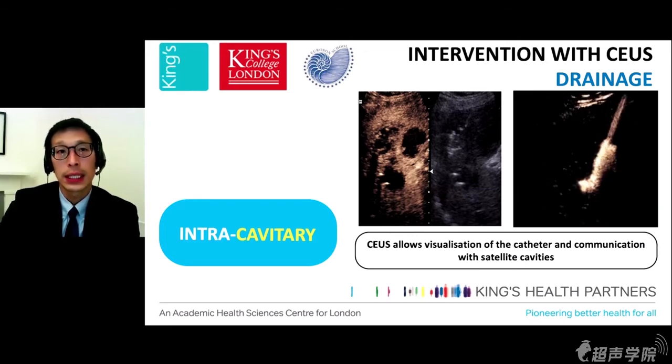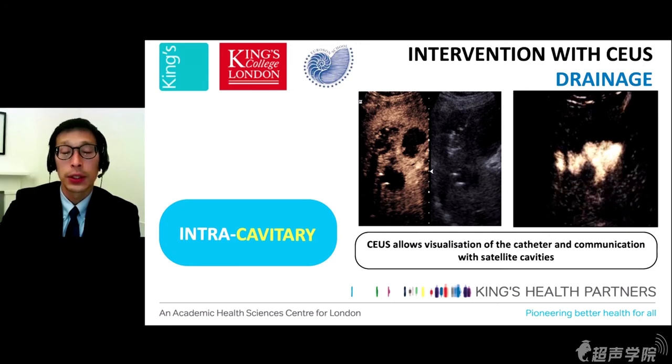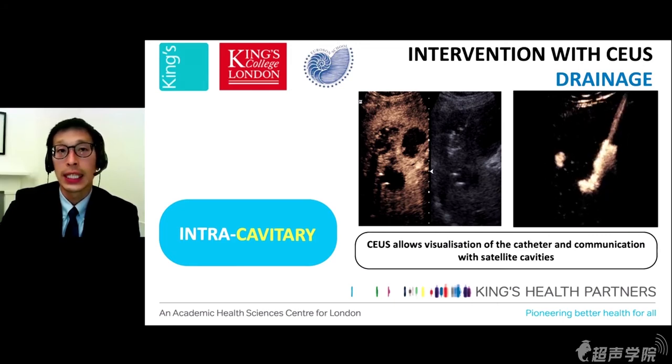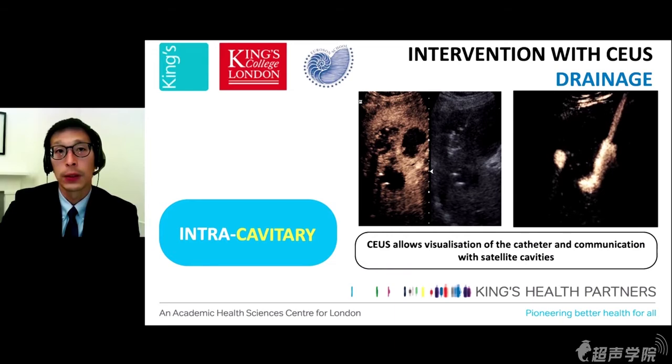And by doing that, it'll help us, one, to confirm the catheter is in the right place, and two, it will help you to delineate the morphology of an abscess or collection. This is particularly useful if there are multiple pockets of abscess within the organ, and what you want to know is that your drain is effective in draining each pocket of the collection.